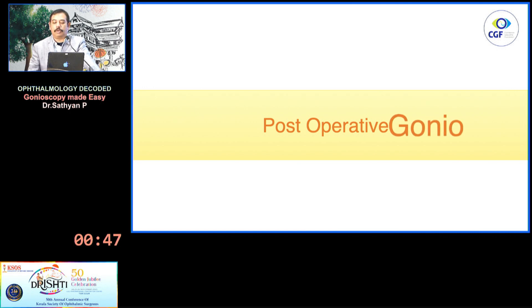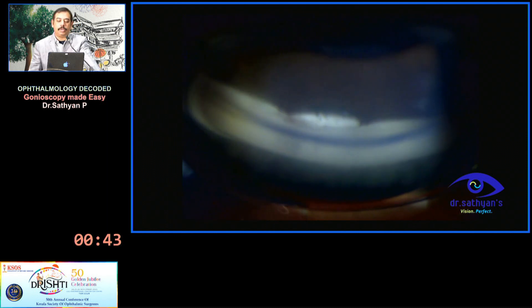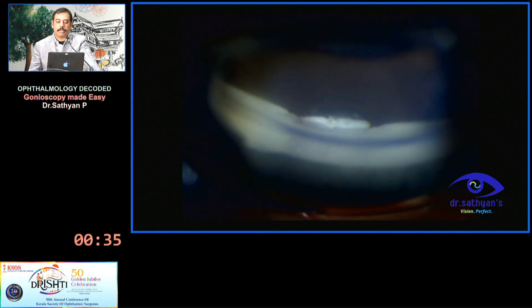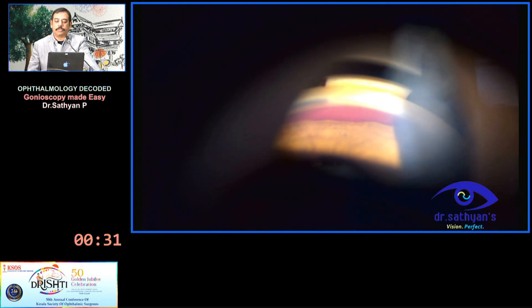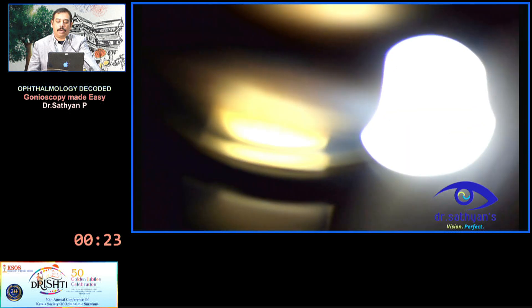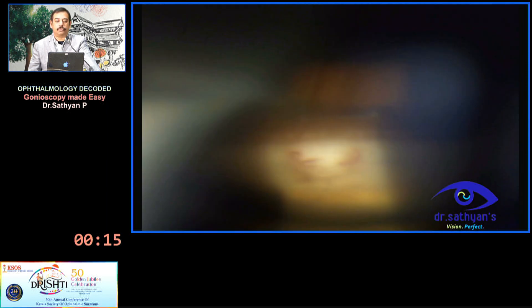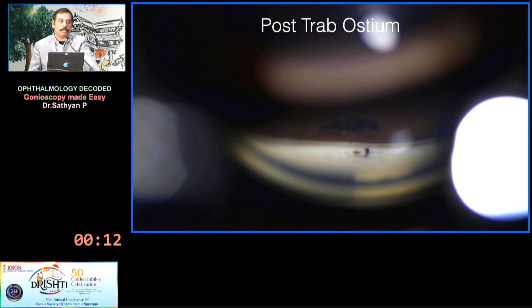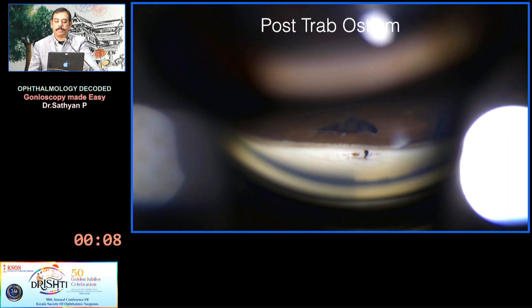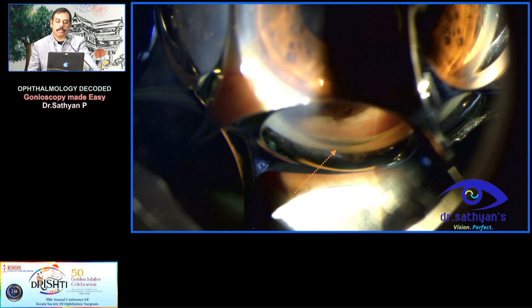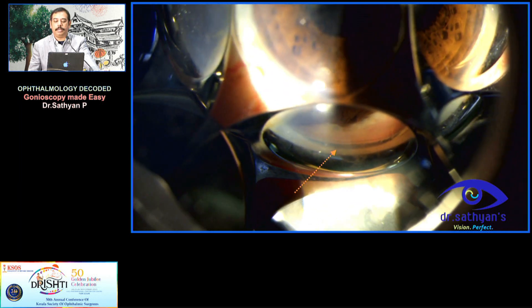In post-operative conditions, gonioscopy is again very useful. You can see the ostium — the two iris pillars coming into and clogging the ostium, but not completely. This helps you understand what is going on. In one case of pseudo-exfoliation glaucoma after trabeculectomy, there was very little hyphema that I missed clinically, but through the ostium you could see it oozing from both sides — very typical of pseudo-exfoliation glaucoma. In another case the post-trabeculectomy ostium is open with only a few pigments, meaning the problem is coming from somewhere else. In another case the ostium is completely clogged by iris, so the cause of failure can be easily identified and treated.